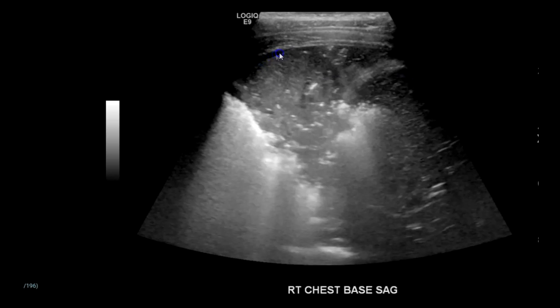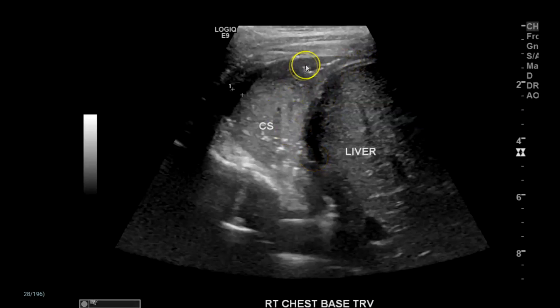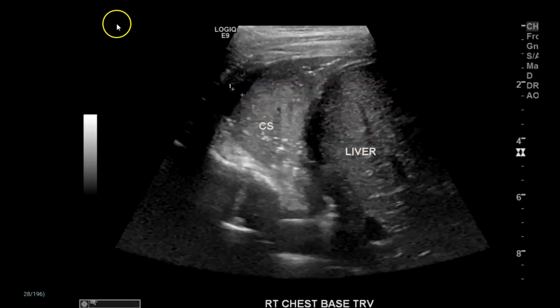You can see there's a tiny bit of trace pleural fluid. So here we have the consolidated lung, a tiny bit of pleural fluid, and the liver.